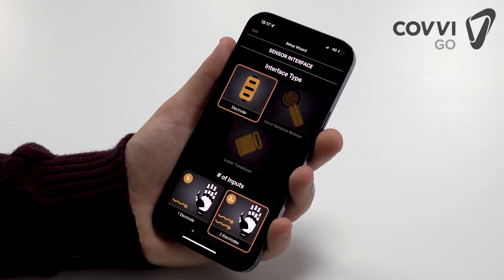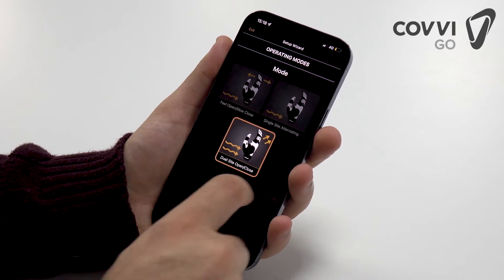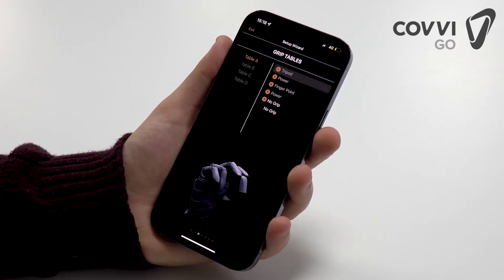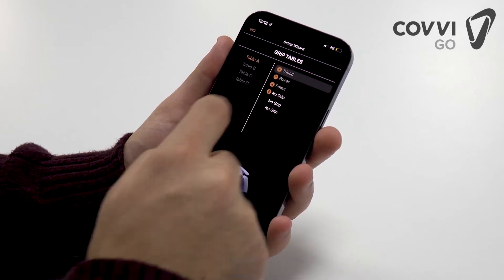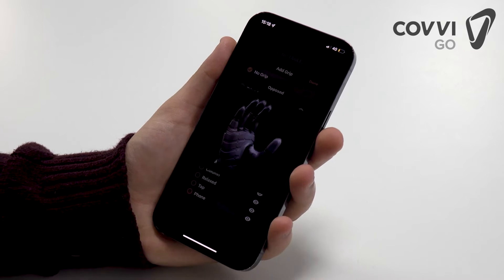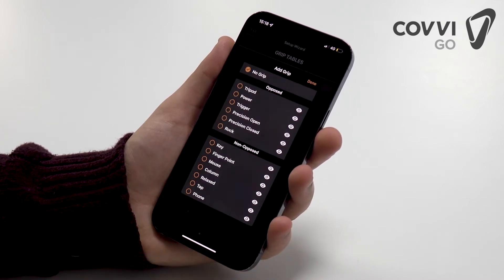The setup wizard guides a user through the app and its settings, preparing them to adjust the hand to make it truly their own. Users can also organize tables to customize the hand with a variety of different grips. They can preview to see what each grip does, and design their tables to make sure they can access the grips that are most useful to them.